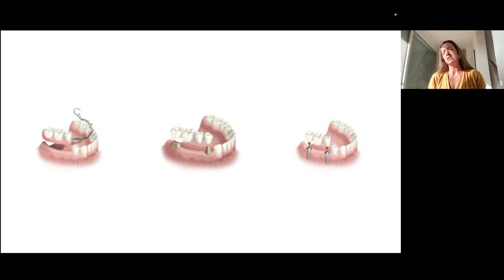But nevertheless, it's a cheaper solution, and sometimes we use it as a provisional solution while the implants are healing, if they don't have enough primary stability to be loaded immediately.